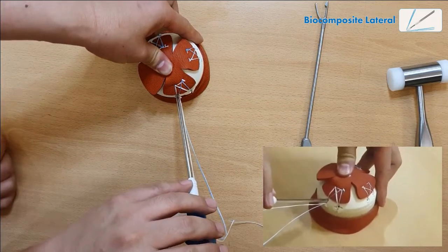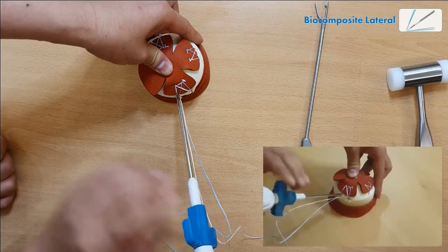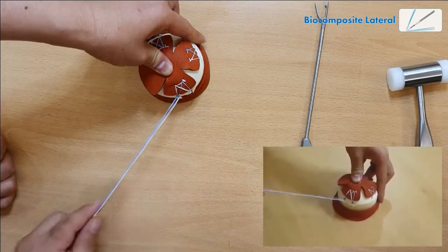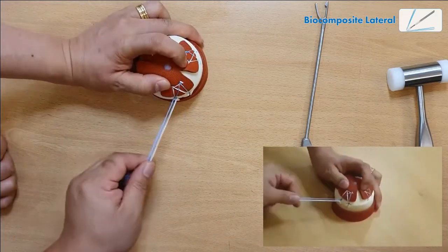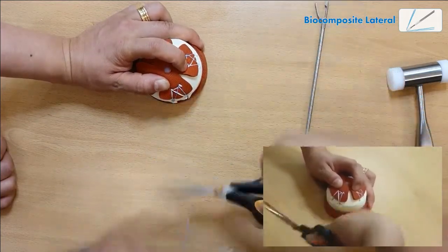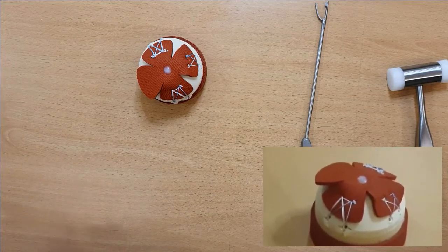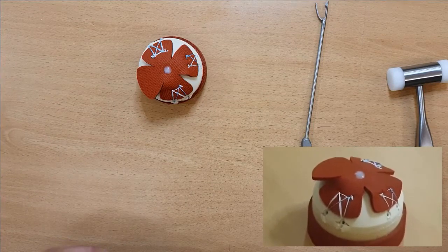Just remove the locking fiber wires and this is all done. As you can see there is no twisting of the fiber wires when the anchor goes in and there is no unwanted tension on the cuff.